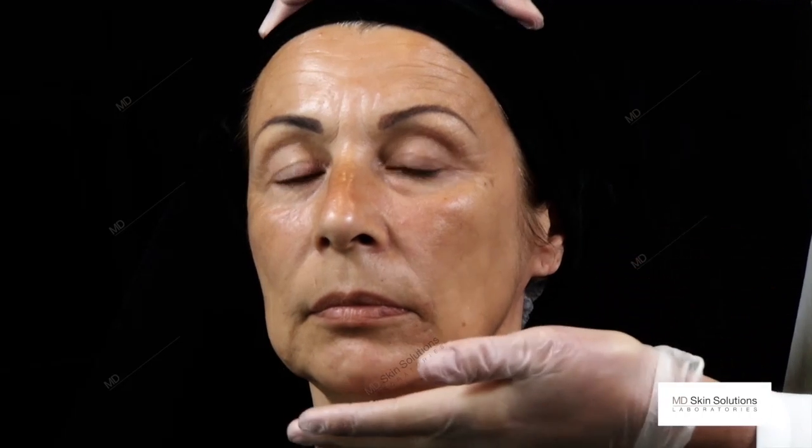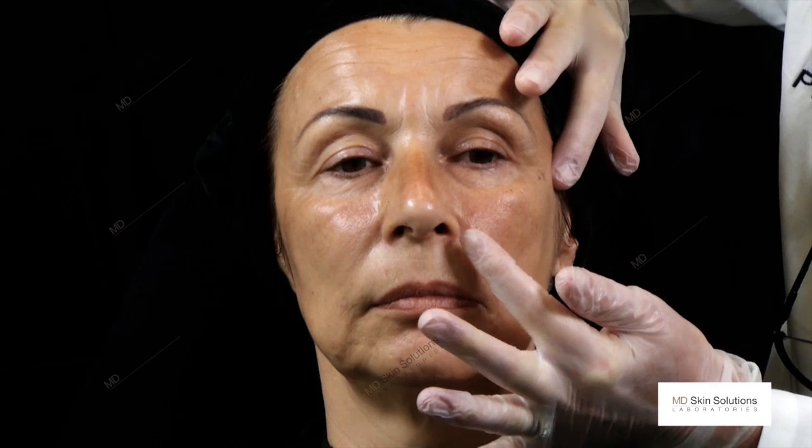definition of the jawline. So the objective of this session is to give her back a lateral lifting, a frontal projection of her cheeks, an attenuation of the nasolabial fold, as well as the pre-jowl sulcus with a little smart lifting of the corner of the mouth.